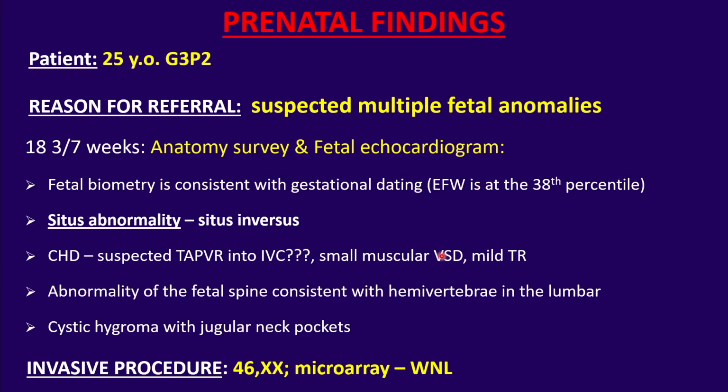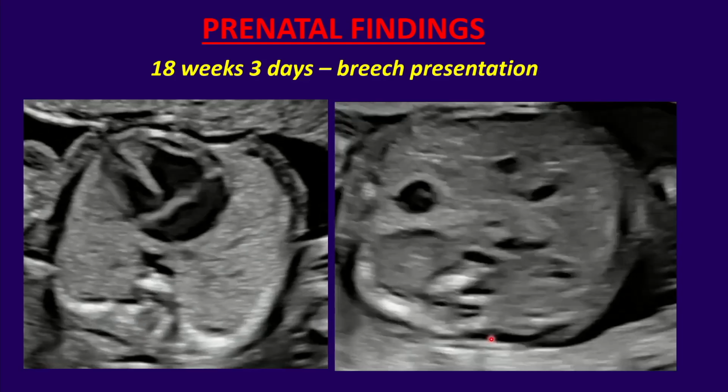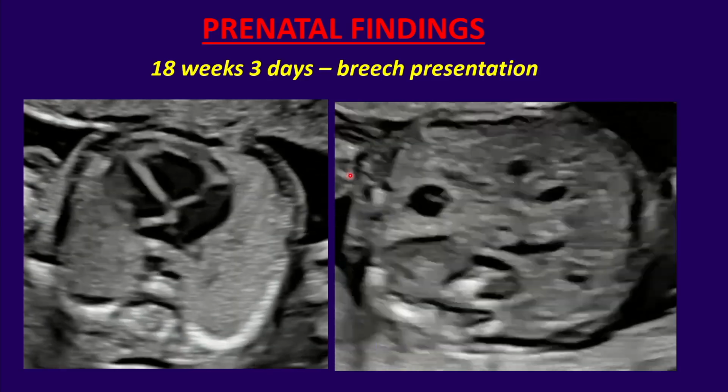We suspected total anomalous pulmonary venous return, so that was a really interesting exam. We tried to figure out what's going on here. Alrighty, so this is again the fetus in a breech position. This is the baby's left side. This is the right side.